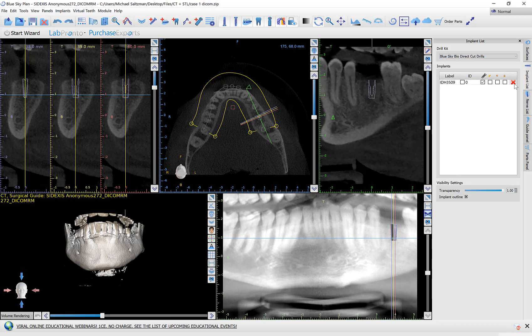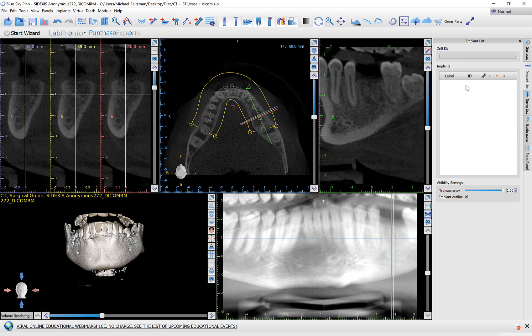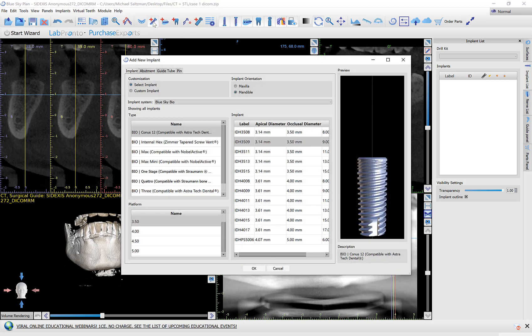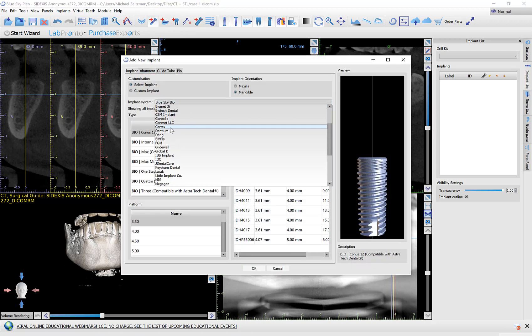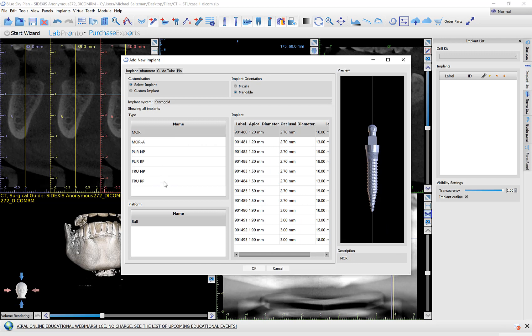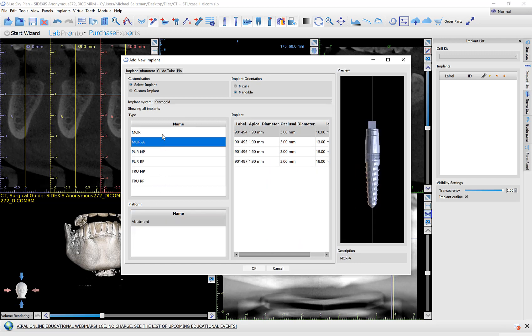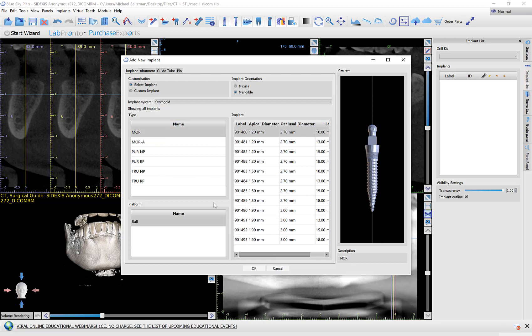If I go ahead and delete this implant, then I have my full list again because I'm no longer limited by the implant that I placed. So if you haven't placed any implants and you haven't selected any drill kit, then when you click add implants, you have the full list of implants and you're not limited by any previous selection. If I select a particular system, I can see all of the implant systems and all of the implants available.